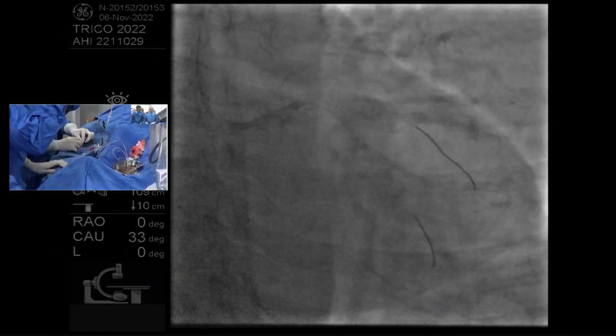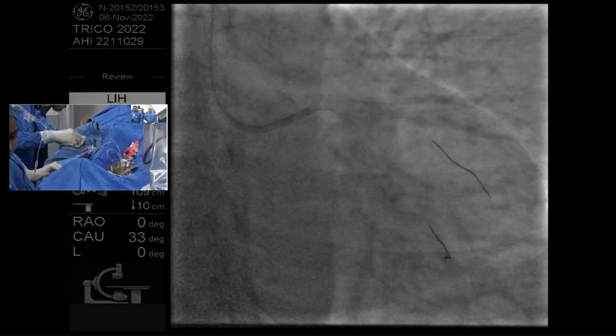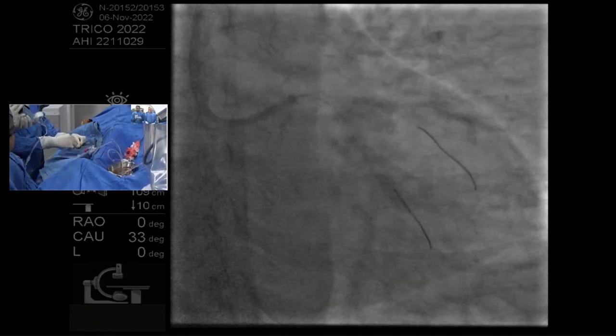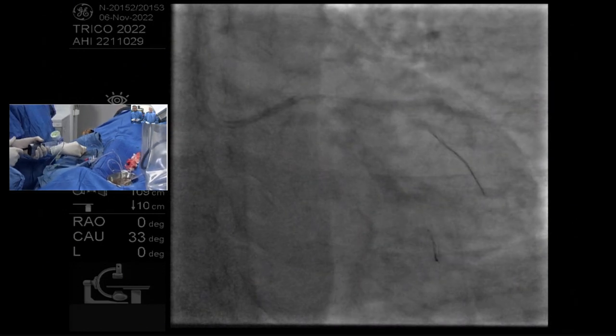You know, Indian guys will like this, because many times the balloons are being reused. That's right. And they can be of great use here. This is the perfect one for a, what do they call it, Oxford balloon? Oxford. See, I'm learning the lingo, right? This is perfect for an Oxford balloon, right?